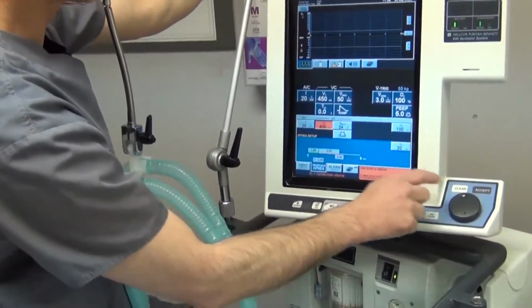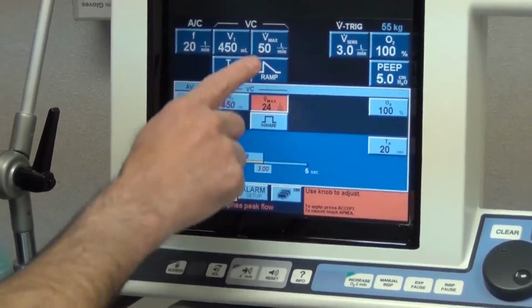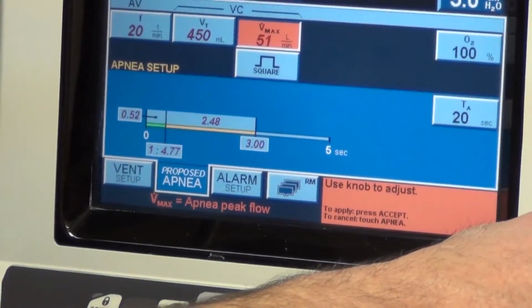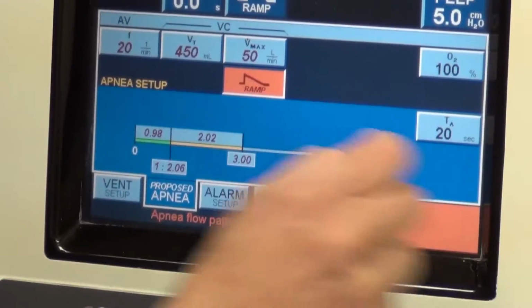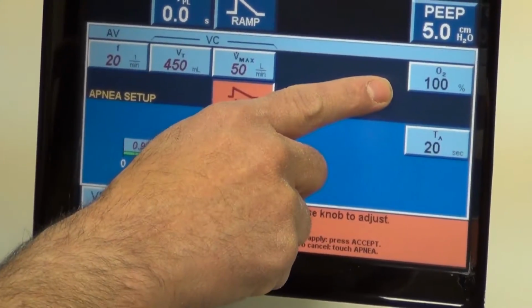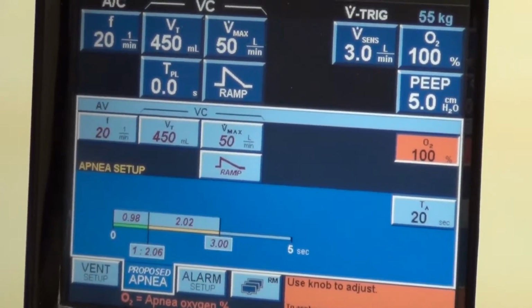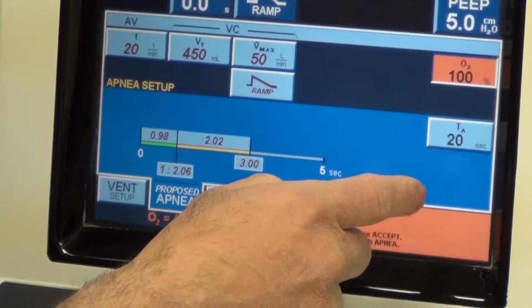We're going to do 450 just like above. And we're going to change our flow to 50 as above. And we're going to change to a ramp. And then we go to our FiO2. This is a backup mode. We don't know what went wrong with the patient. We want to keep it at 100%.